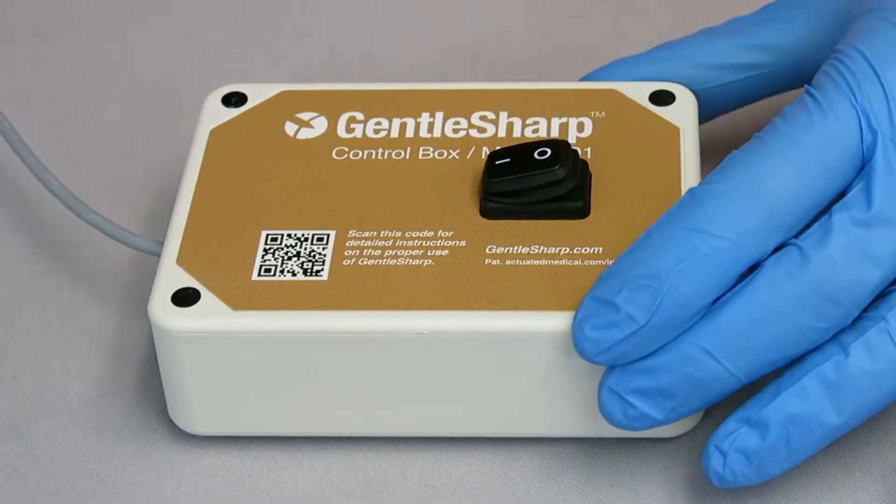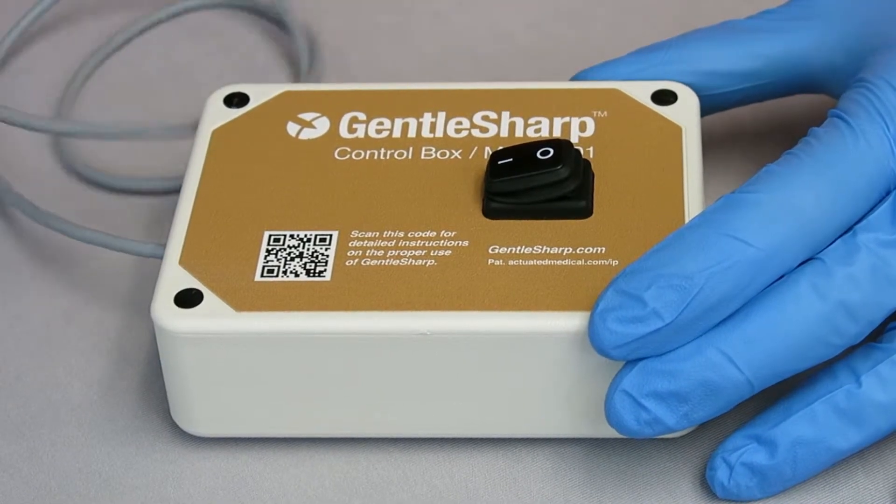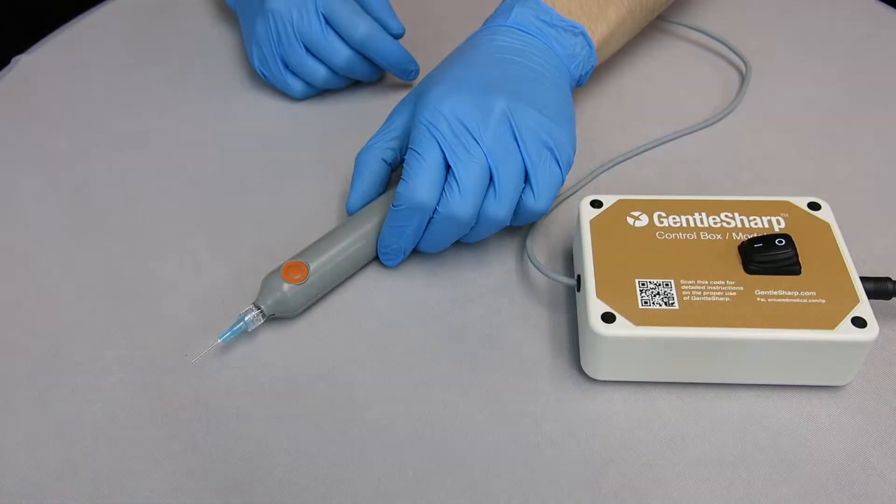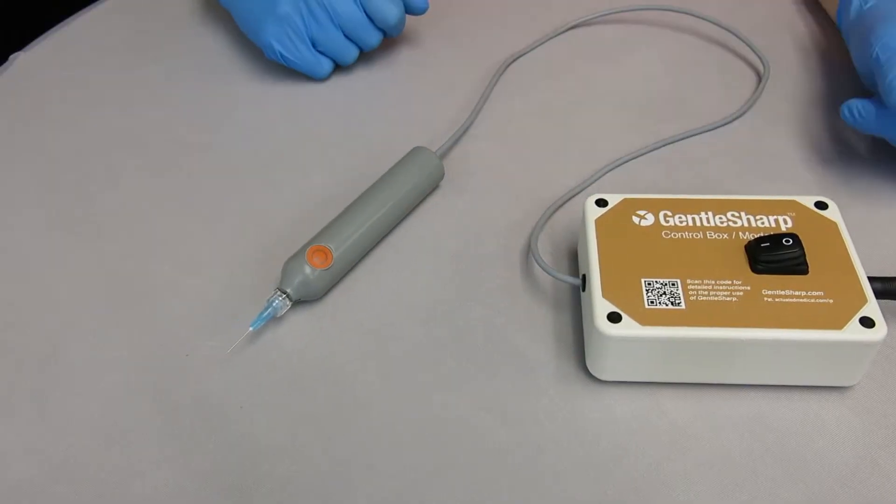To reduce the risk of the control box or handpiece falling, place the GentleSharp control box and handpiece on a level surface. Store the handpiece before and after each use to reduce the risk of the device falling off the surface.